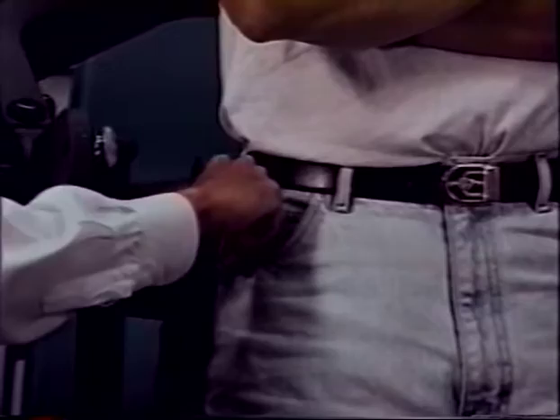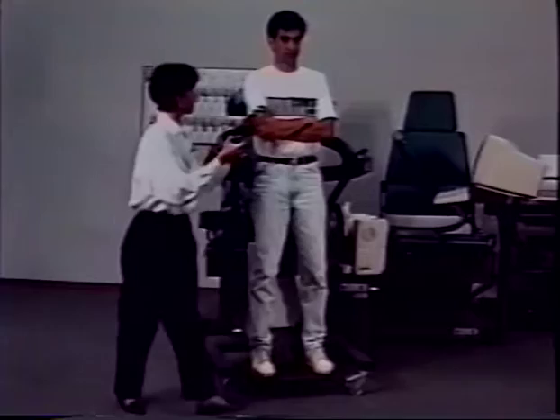Foot plate height can be recorded. All adjustments are scaled for reproducibility. Secure the pelvic belt loosely around the patient.